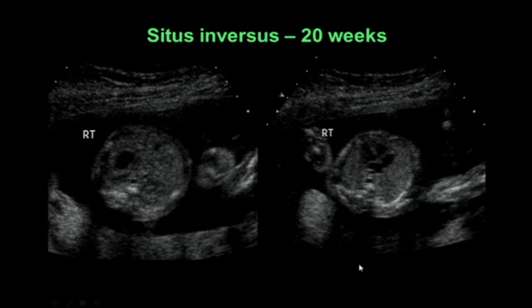This fetus did not have a stomach in the left upper quadrant, but rather in the right upper quadrant. Here you can see it here. And when we take a view of the lower thorax in the same fetus, we see that the heart is on the right as well, rather than on the left. So this is a case of complete situs inversus.